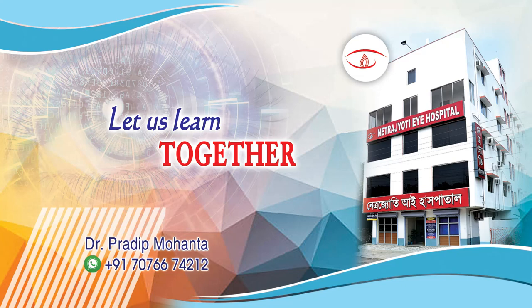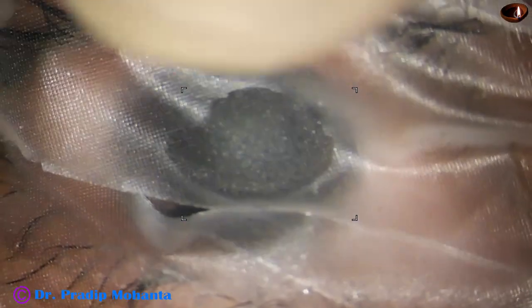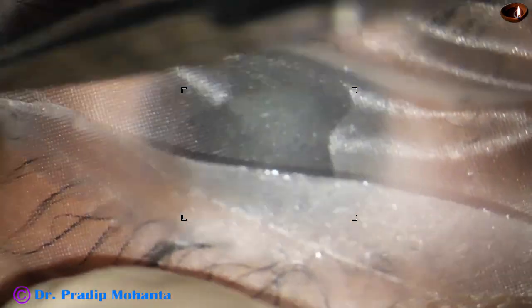This video is dedicated to ophthalmology residents all over the world. This is a totally unedited recording. In this video we are going to learn SICS, Small Incision Cataract Surgery.